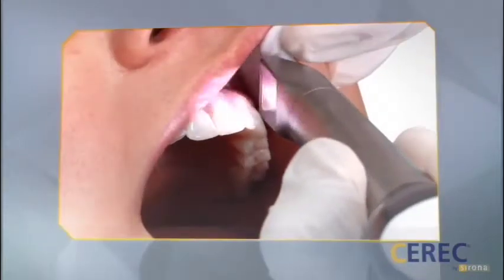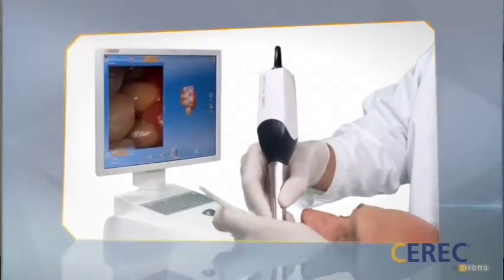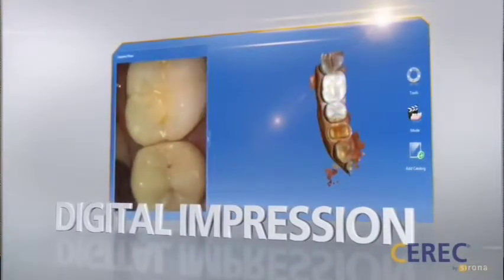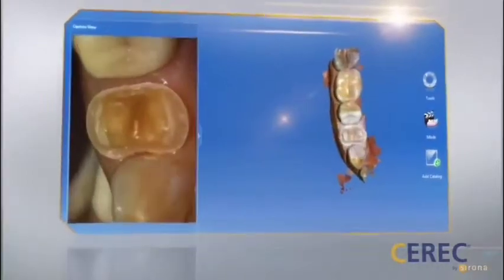Really? Yeah. So it's like a 3D printer? It's similar to that concept. It's three-dimensional imaging, just like you would with a printer, except instead of actually printing it from nothing into something, we're actually taking it from a block and we're actually milling it down to something that we want to use. Okay. But a very similar concept. All right. Now, what are the advantages of this over dentistry from previous years?